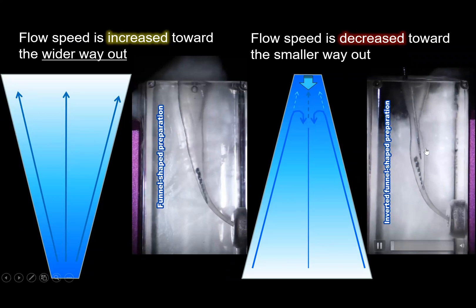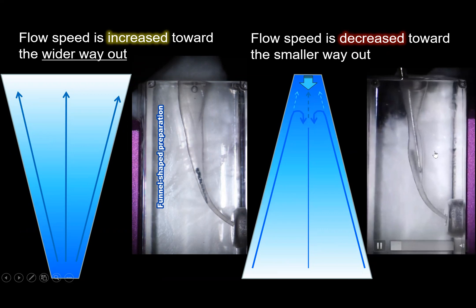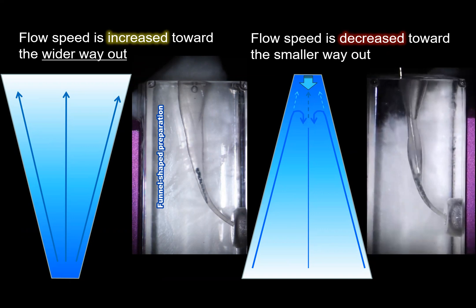So let's look at the video on the right. I'm going to activate ultrasonics. However, you can see the instrument dancing, but it's not coming out because of the smaller way out.